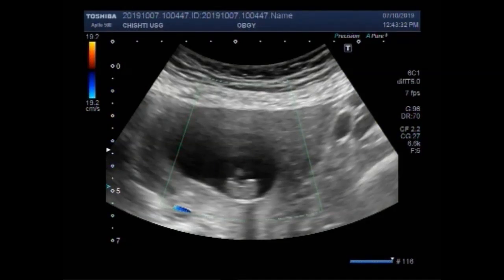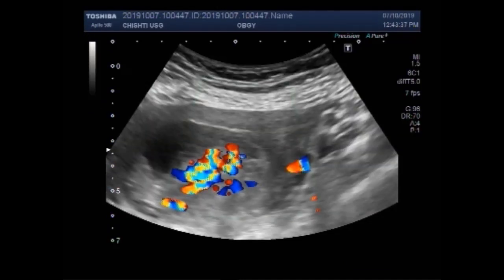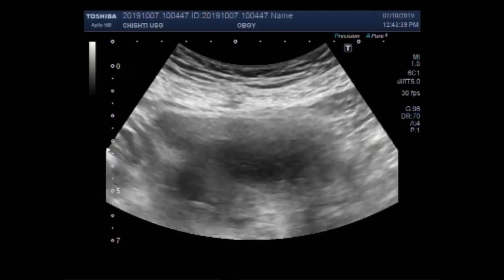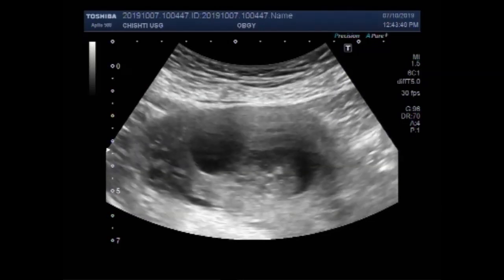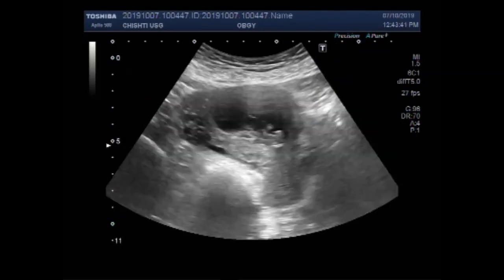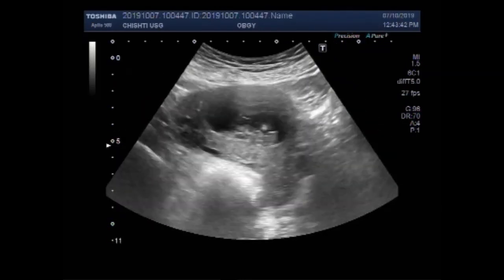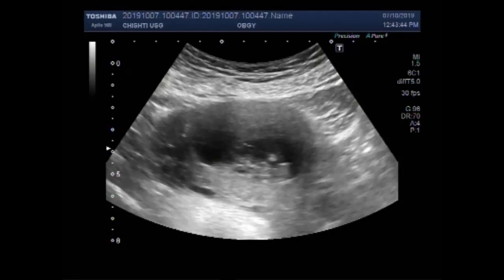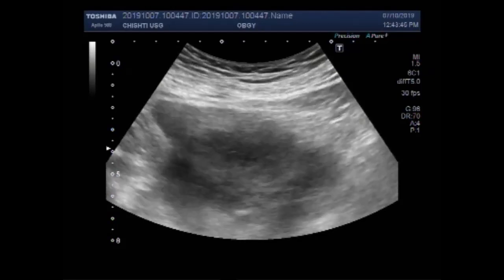Dear viewers, I hope you are all fine. This ultrasound video shows an early pregnancy with fetal demise and an ovarian cyst.